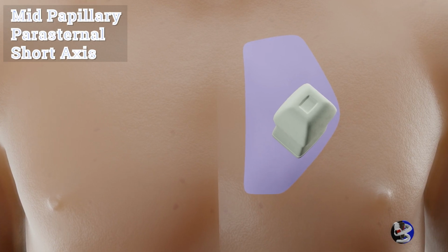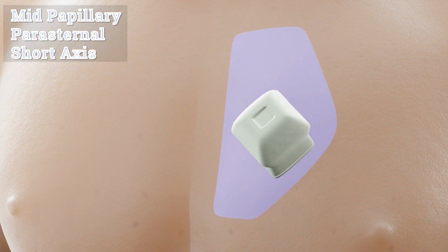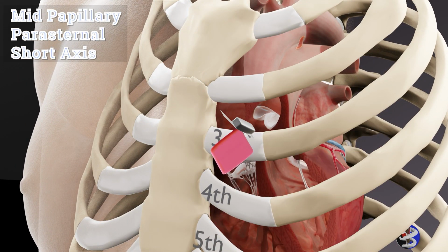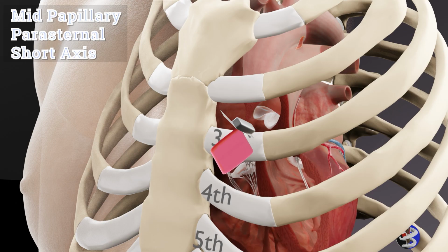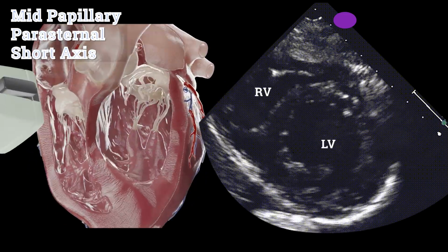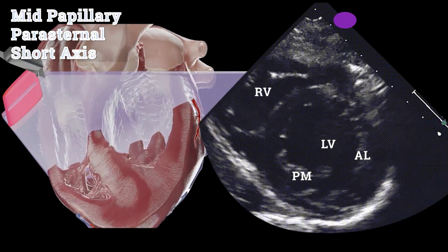Parasternal short axis view. The indicator of your cardiac probe should be towards the left shoulder. The probe is positioned between the third and fourth intercostal space. However, the area of interest may be along the left sternum, which is why it's called a parasternal view. So you may need to go up or down an intercostal space. This is the mid-papillary view. We're cutting through the anterolateral and posteromedial papillary muscle.